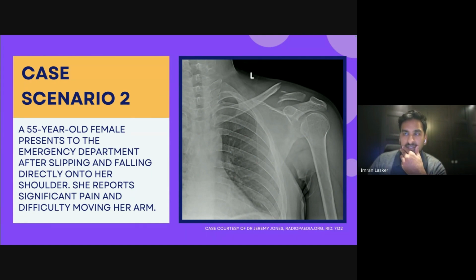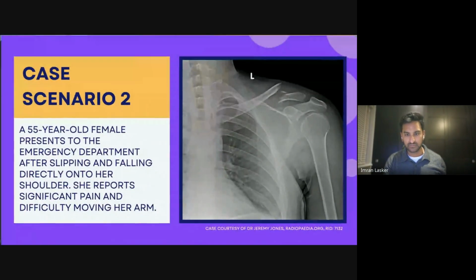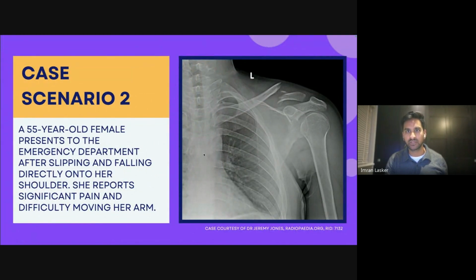Okay, let's have a look at this one and get you guys to think about this. I don't have access to the chat as far as I can see, which is a bit weird for this thing. Let me see if I can grab it. No, oh no, I can. Okay, maybe that does work.